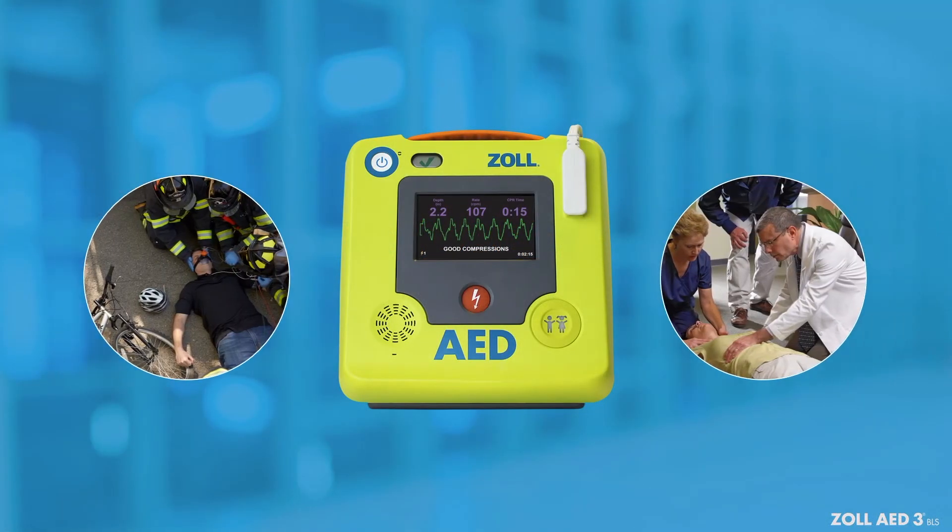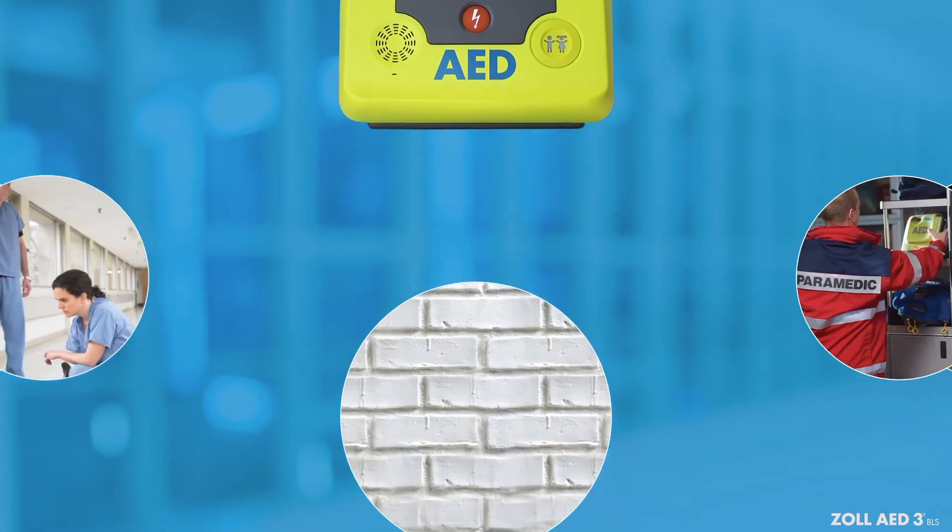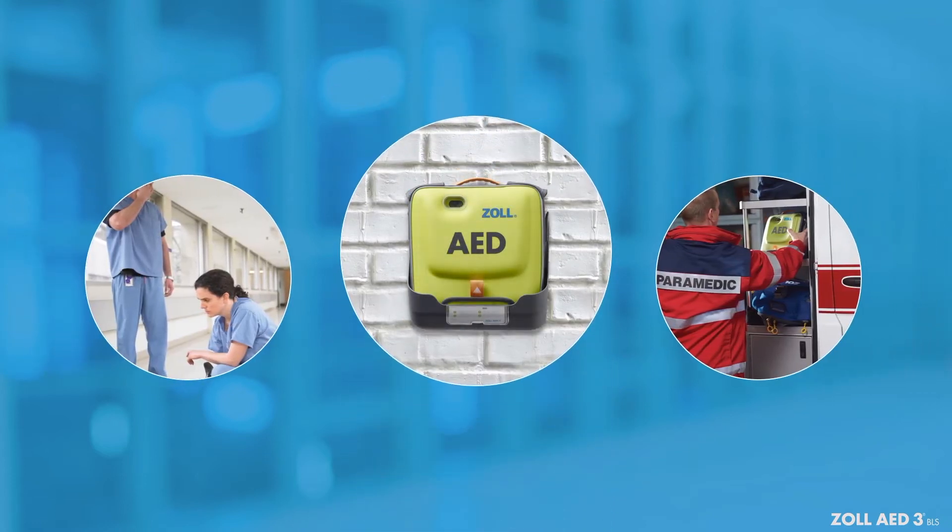No two rescues are alike. Let's review how to use the Zoll AED-3BLS so you feel confident should you need to use it. The Zoll AED-3BLS can be customized to local protocols or regional guidelines. This review covers basic functions. Please familiarize yourself with the settings your Zoll AED-3BLS will use.